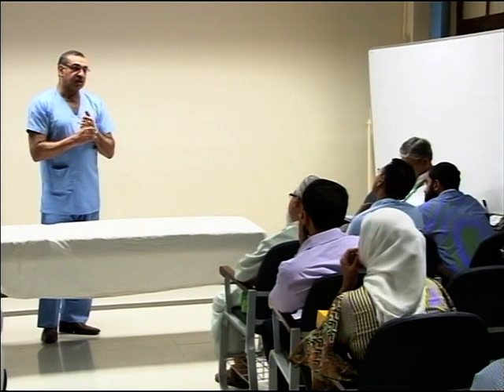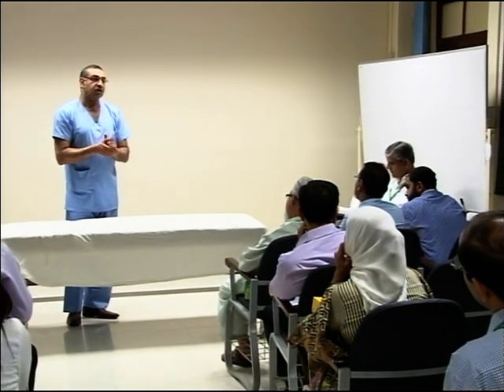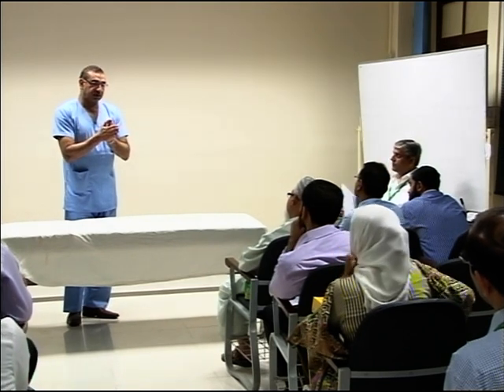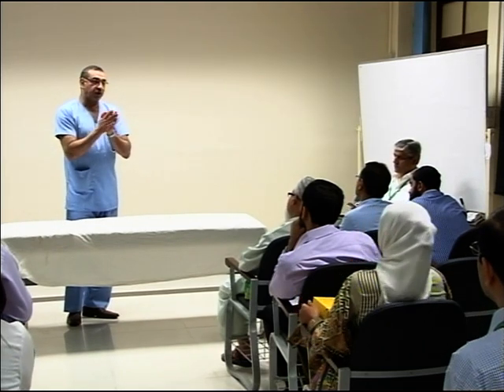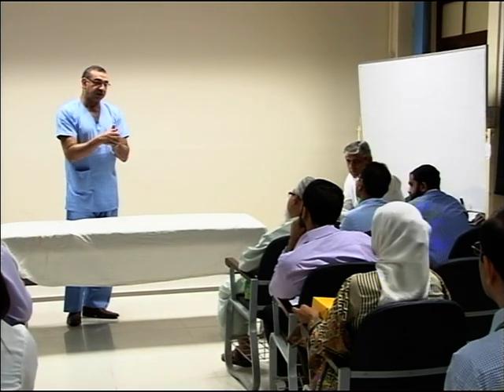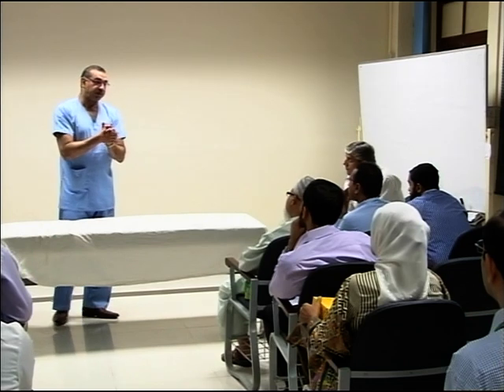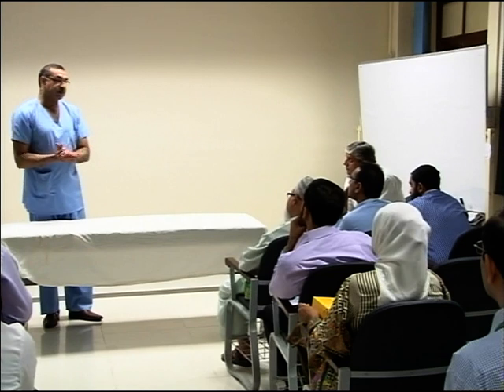Where do you use the APC? APC specifically for angiodysplasias, for post-radiation colitis, for watermelon stomach, sometimes for clearing out the tumor ingrowth from stents. We use a different setting for that. Sometimes for extensive bleeding from a tumor, and just spray that with APC.